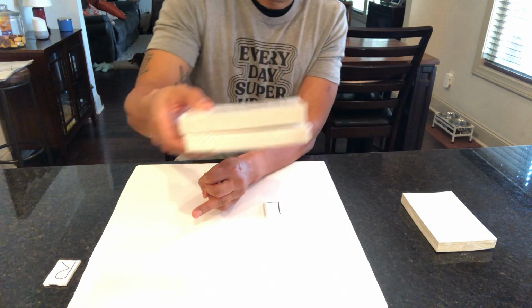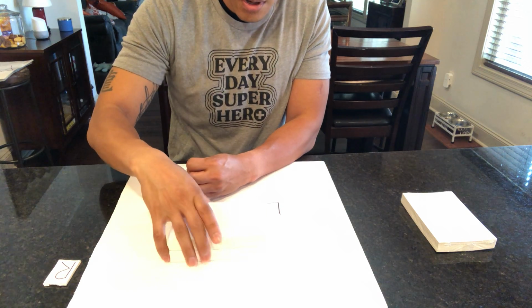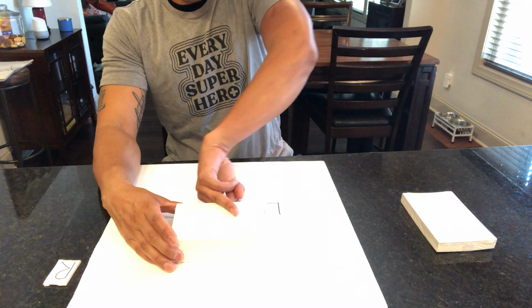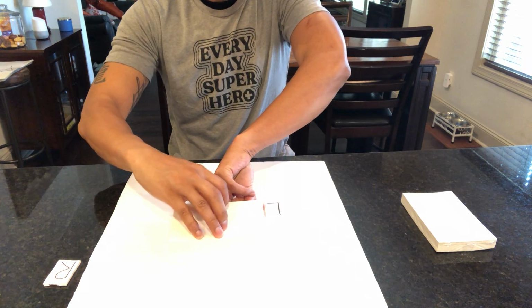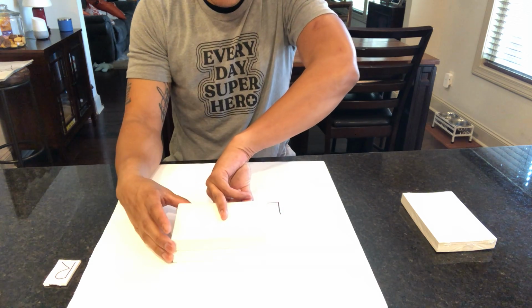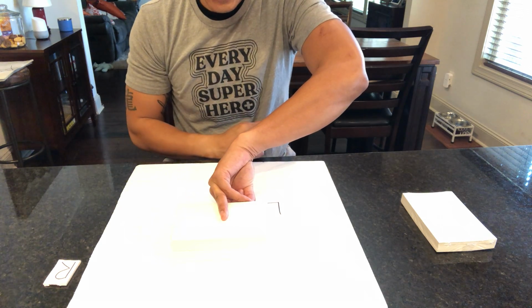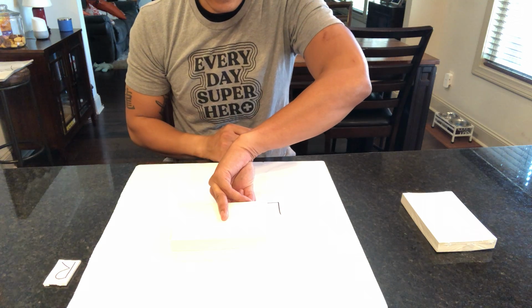Now lateral finger. I'm using these index cards as a simulation of a sponge, but what we're going to do is place the finger here, again parallel to the film plane. Now keep in mind on the lateral projection of the fingers 2 through 5, there's a little bit different.